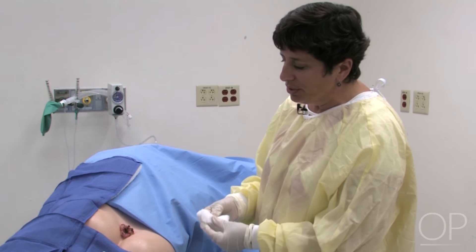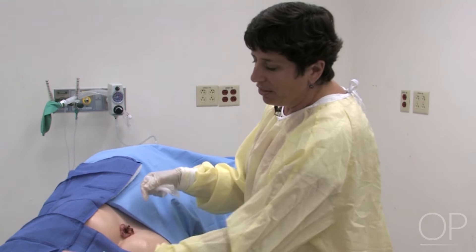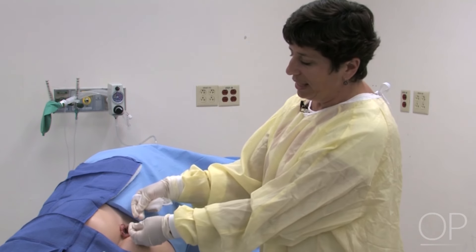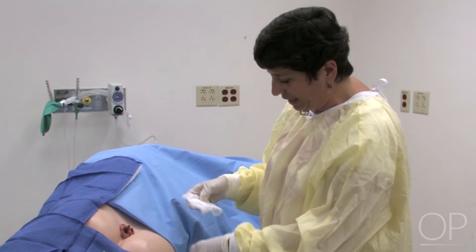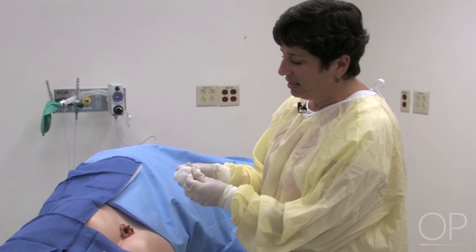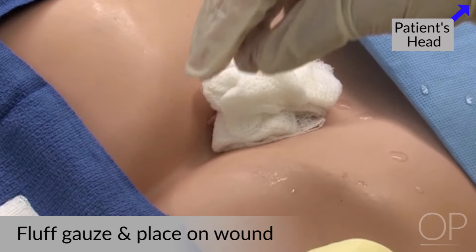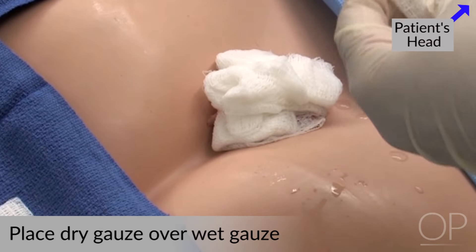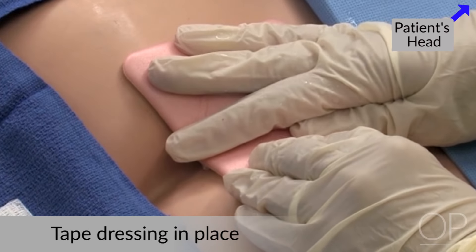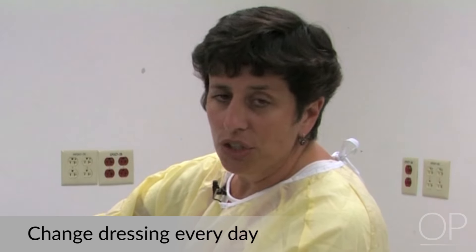For this wound, I'm going to choose a moist gauze covered with a dry gauze, and then we'll use a foam dressing to help absorb some of the drainage. The goal for this wound is to get that slough and eschar to come out of the wound so that we can see what the base looks like and then get it to heal from the inside out. So now that I've cleaned it, I'm going to take a piece of damp gauze and fluff it onto the wound, then place a dry gauze over that, and then put the foam dressing over for extra protection, insulation, and padding. Then I would tape the whole dressing, and change it at least once a day or if it became soiled with stool or if drainage came through to the foam dressing.